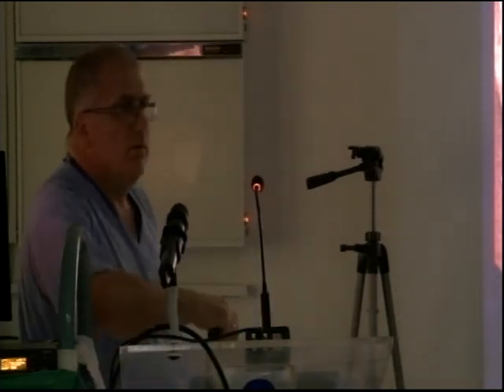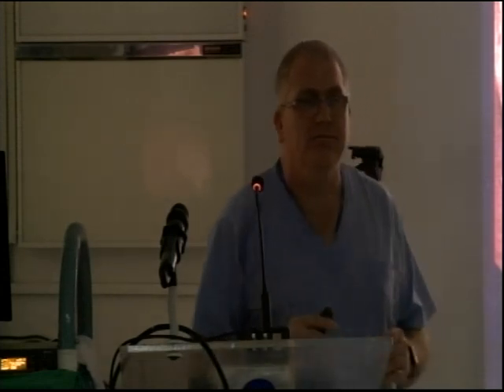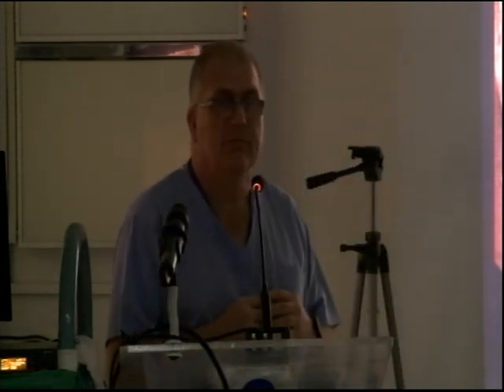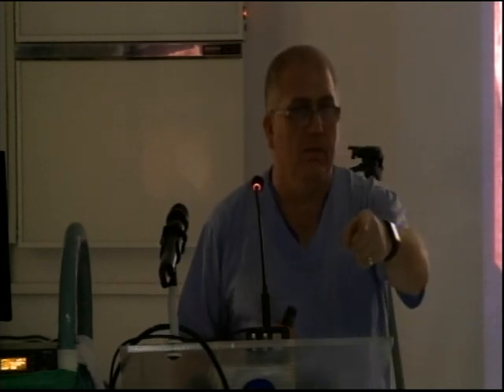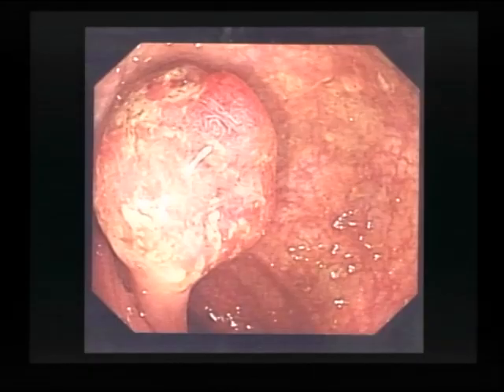So, what is this? I'm going to actually be very pointed. I'm going to say, what is this? Polyp. So what type of polyp? Pedunculated. Right? What do we look at before we actually... We've got this polyp. Would you consider taking it off? Yes? What would you do? Take biopsy. So how are you going to do the polypectomy?